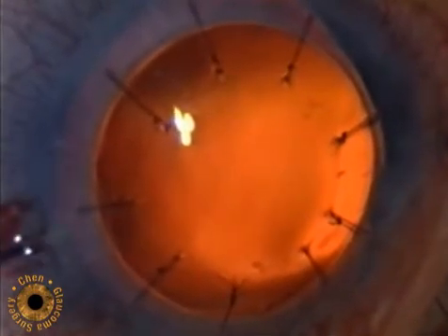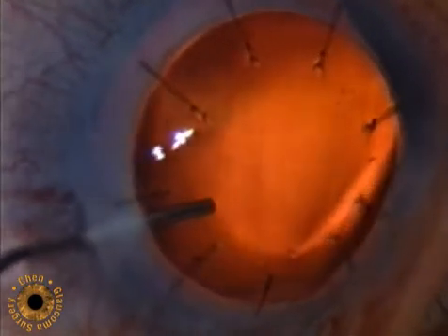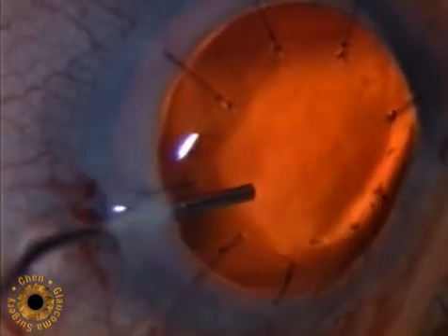After entry with the keratome, viscoelastic is used to fill the anterior chamber and elevate the iris.